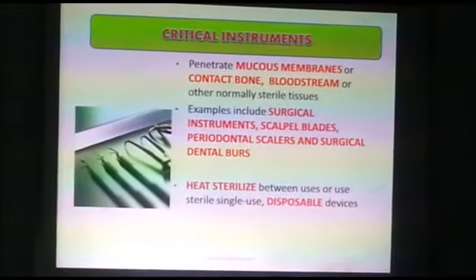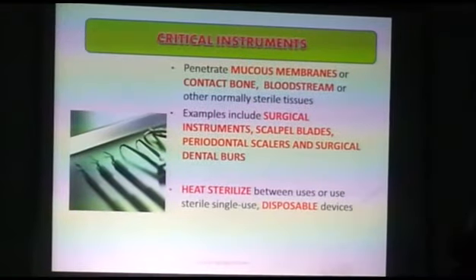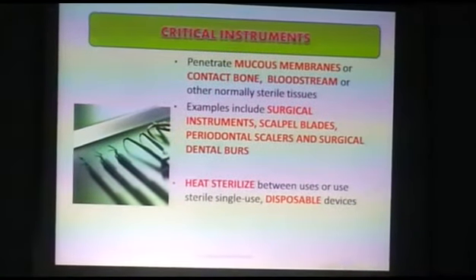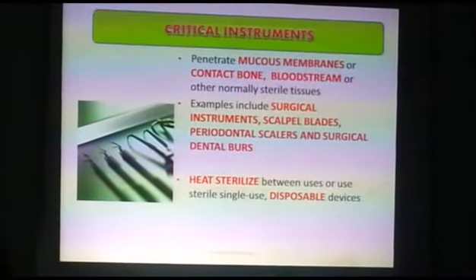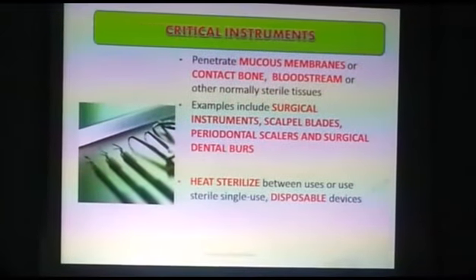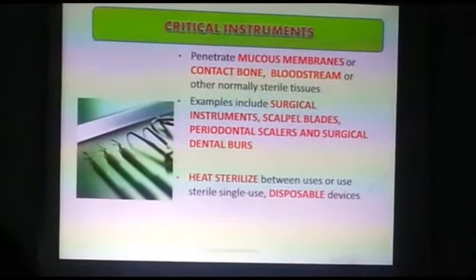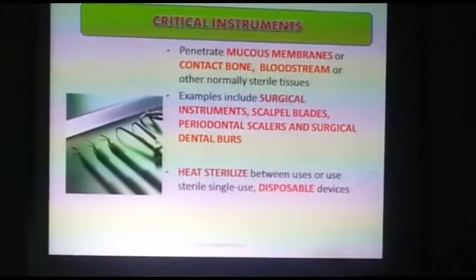So what do you think about the sterilization of these instruments? High risk. These instruments should be sterilized using heat sterilization, or otherwise we may use disposable instruments. Now we have disposable instruments, which we have to change for each patient.